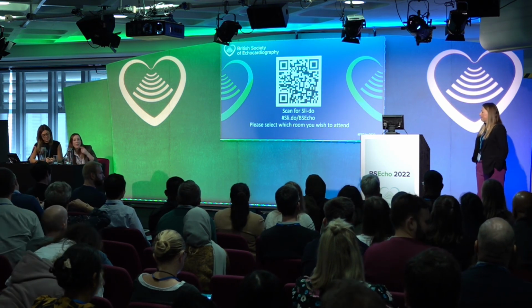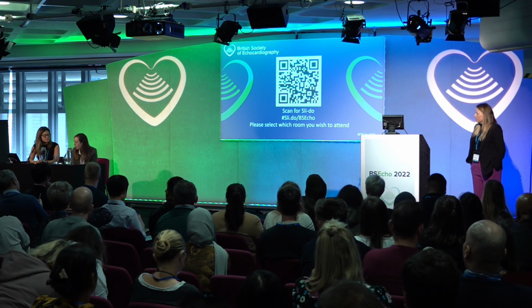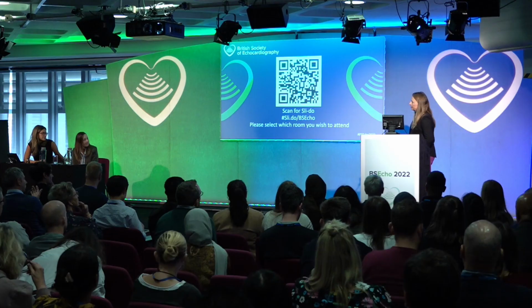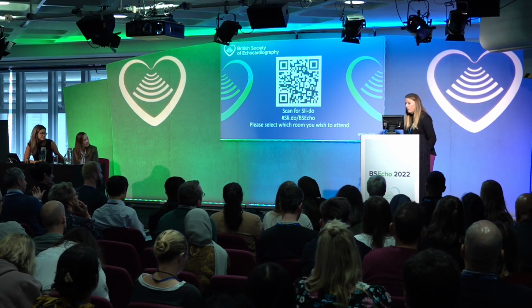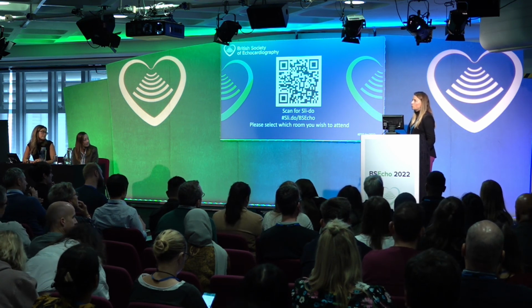Thanks, Emma. It was an amazing practical overview of how we can do those measurements. So thank you. I think we've got a couple of questions come in. So one of the first ones is, do you routinely measure and use left atrial area as part of your assessment? Would you ever use that in any situation? I don't. I know there are people that do. Where I am aware of it being measured, it was a sort of interim step between left atrial diameter and volume. And now that we have volume, I think we all appreciate that that's a more accurate measure. So I would go for that.